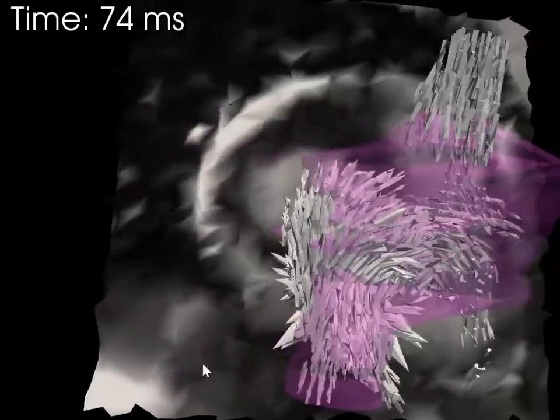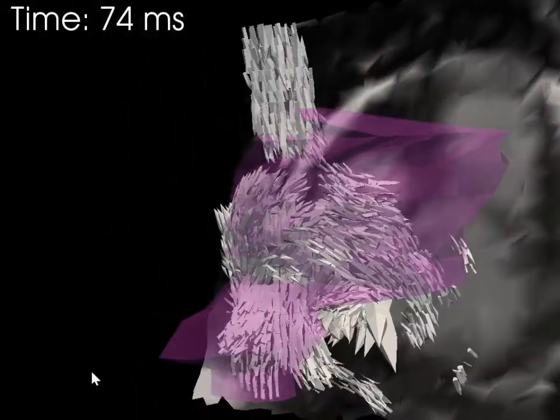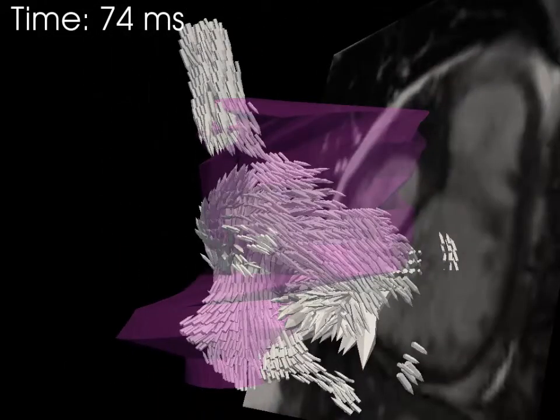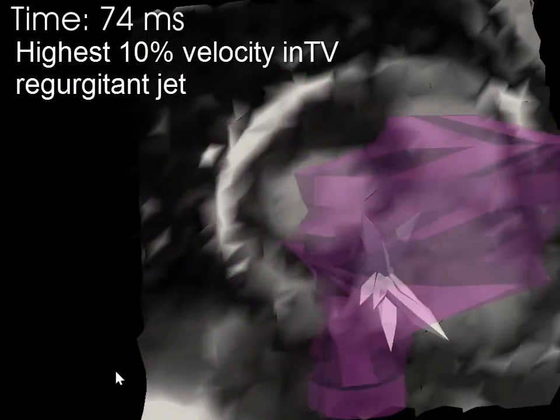Flow from the hepatic vein wraps around flow from the inferior vena cava and is joined by flow from the superior vena cava in a circular motion prescribed by the walls of the atrium.